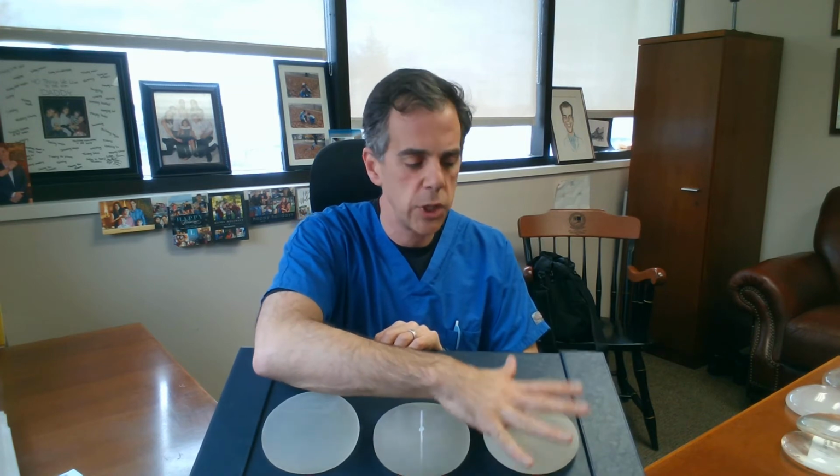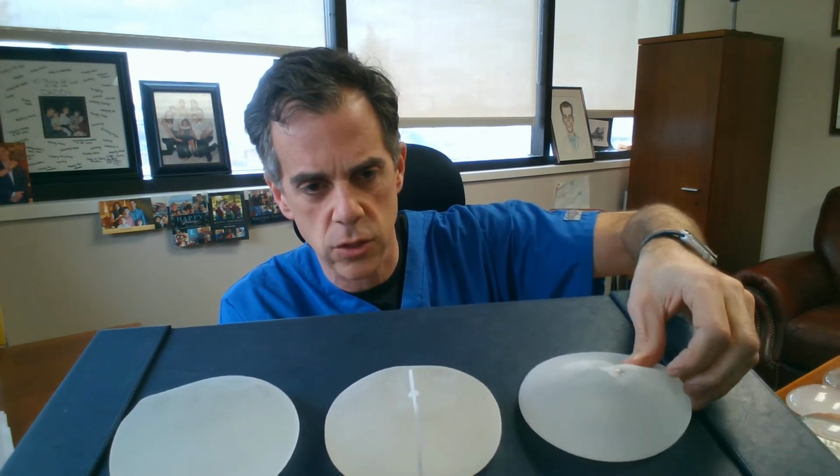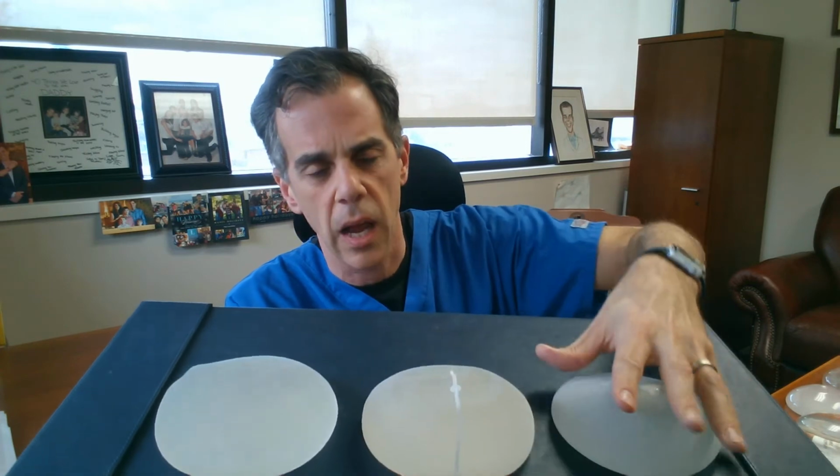But there are different implant companies, and the difference between a textured or shaped implant and a smooth round implant, those first ones I showed you, is that these that have a shape to them, these are the three main implant companies, Mentor, Sientra, and Allergan's shaped textured implants. Now, Allergan's textured shaped implant was taken off the market in 2019 due to fears and concerns related to BIA-ALCL, which is still an extremely rare phenomenon. But this implant is not available anymore. Again, most of the patients will do smooth, but you can see somewhat from this, again, more by feel, you can feel a more aggressive texturing or roughness of this compared to the other two implants. And that's what's thought to be related to ALCL. But again, for the most part, most patients are doing smooth round implants.